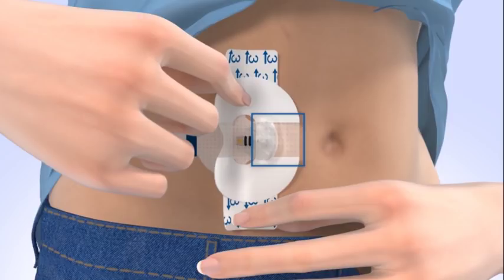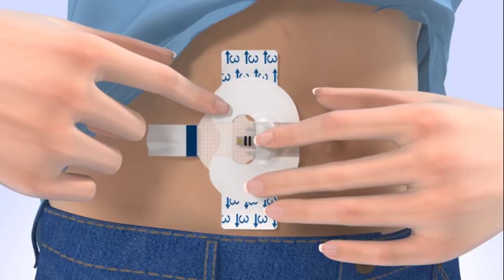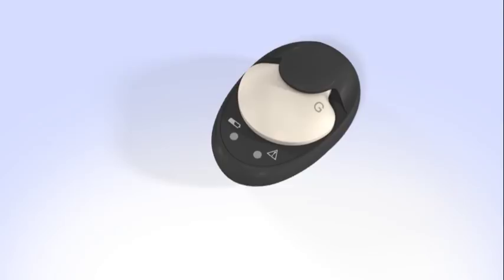Make sure the tape is covering both the skin and the sensor. Then apply the remaining part of the tape onto the adhesive pad, making sure it does not block the sensor connector. Smooth down the tape that was placed on the skin. Then remove the 2 paper tabs marked with the number 3 from the sides of the tape. Smooth the tape against the skin.